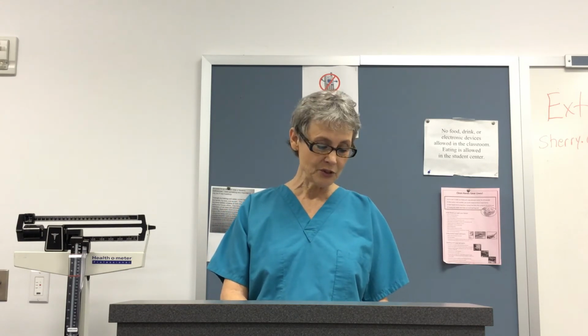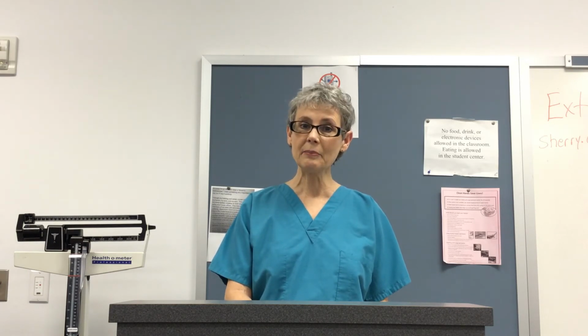A is for allergies, so you assess allergies. T, make sure you have the correct tubing, because you need to have long tubing for the primary, short tubing for the secondary. S is site checked. Yes, always keep an eye on that site. How often? At least every 2 hours.